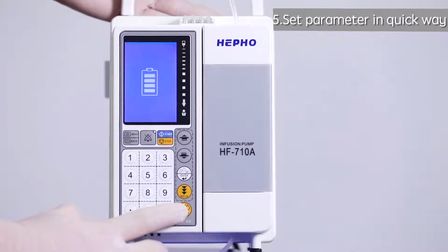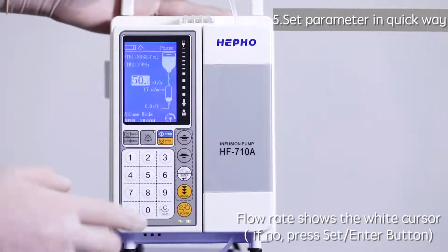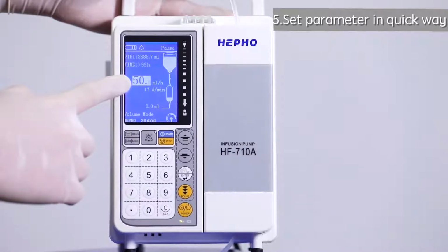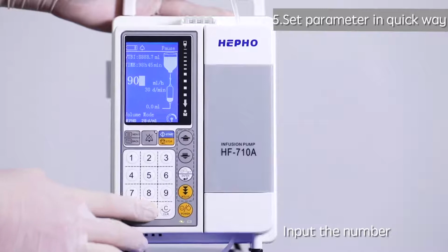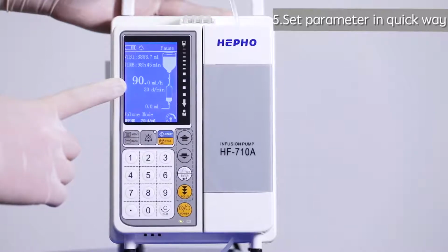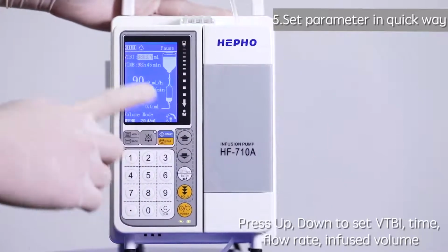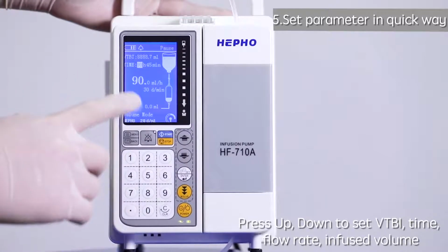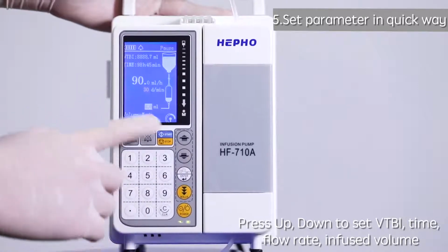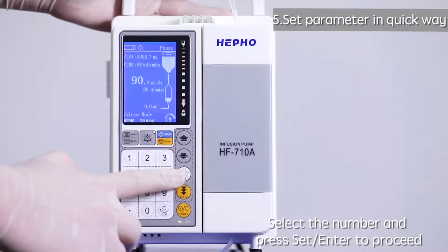5. Set parameter in quick way. Power on. Flow rate shows the white cursor. If no, press Set Enter button. Input the number. If no need to change flow rate, press Set Enter or Up, Down button for other setting. Press Up, Down to set VTBI, Time, Flow rate, Infused Volume. Select the number and press Set Enter to proceed.